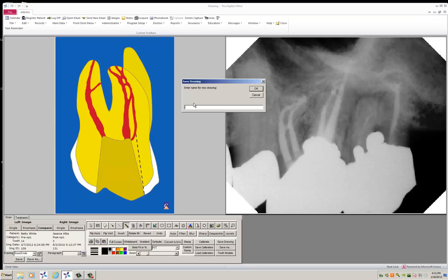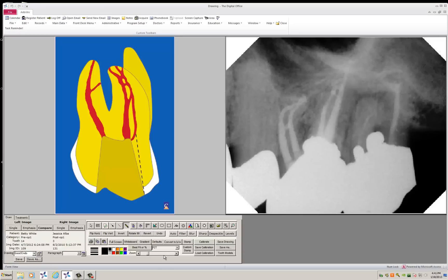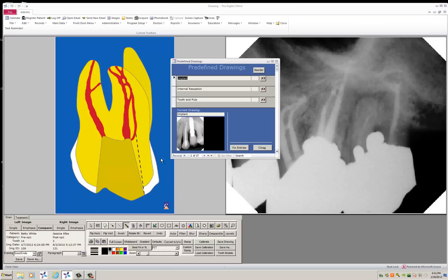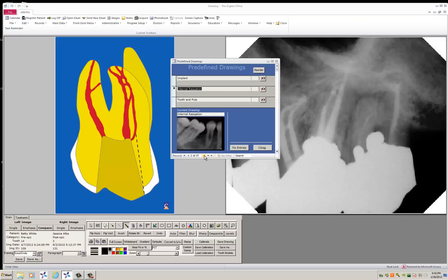And then you actually save that. Save as, let's just call it MB Anatomy 2. As soon as that's saved, it is now in your list. Here it has been saved.